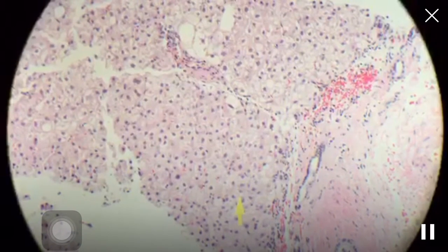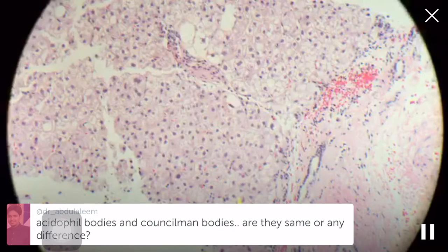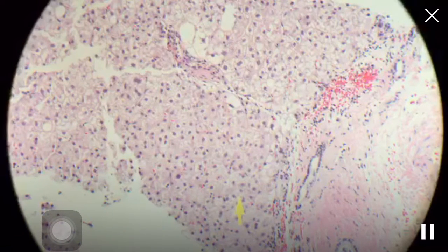Yeah, foamy, etc. A lot of this is also glycogen. So if you really were worried about it, you do a PAS stain and they'd probably be glycogen rich. Or it's microvesicular fat, small droplet fat, and the biopsy isn't so well fixed, and so that sort of disintegrates. It's hard to see. What you really need to see is an oil red O stain, but we're not going to do that because that requires frozen tissue. But I don't get hung up on this. Its presence is what's important.